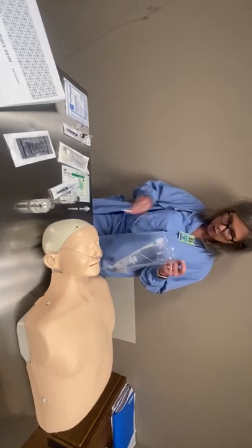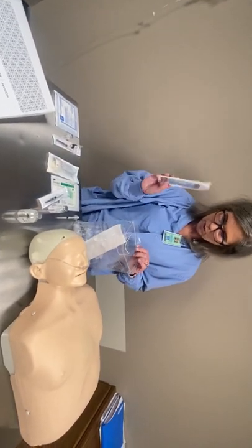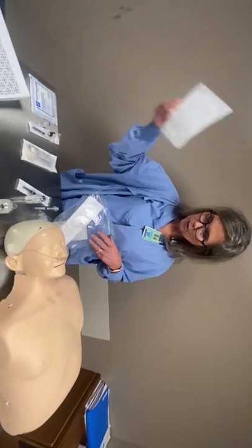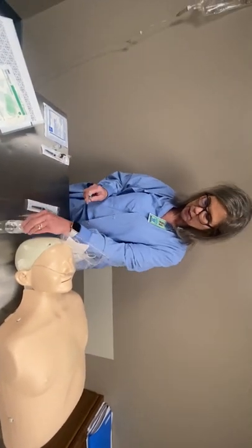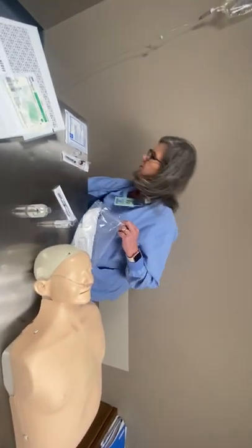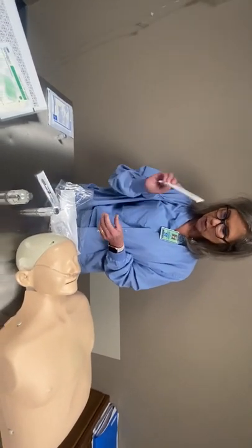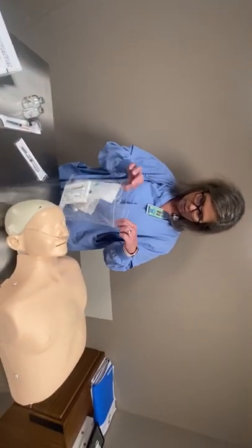Grab the physician's gloves — again, every doctor is different. Most of them use this sterile gel, so put that back in the bag. We've got our op-site dressing to put over the probe of the ultrasound with some jelly underneath. You're going to want to clean the skin, so we'll include that. Pull up your local anesthetic to three cc's and change to the appropriate needle. Then grab your Versed and your syringe, have it all labeled, along with your sterile gauze to wipe everything off.